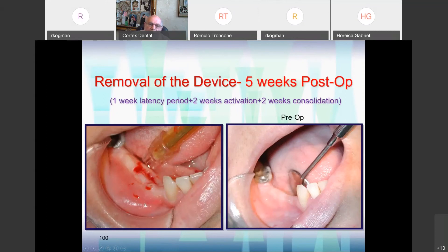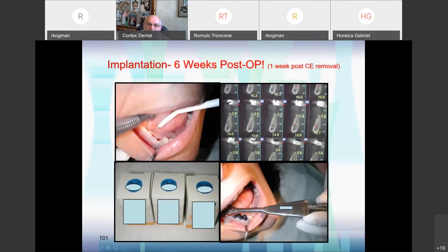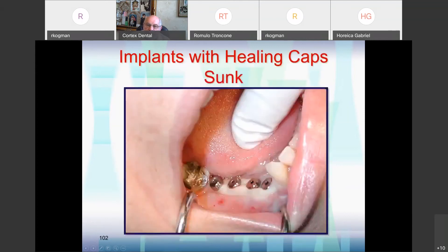I must admit that I made a mistake — originally I thought I had enough attached gingiva and I didn't go with my cut close to the molar. In the end you can see I managed to insert 4.2 mm implants. Here we have nice attached gingiva, but here I have a little not enough — I should have gone closer with my vertical cut to gain more attached gingiva. Anyway, the result was very good.